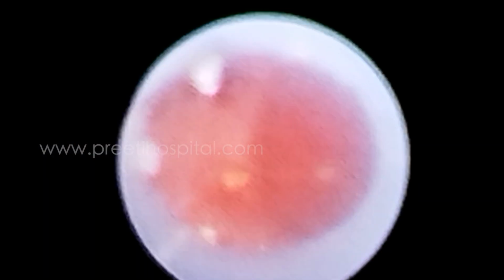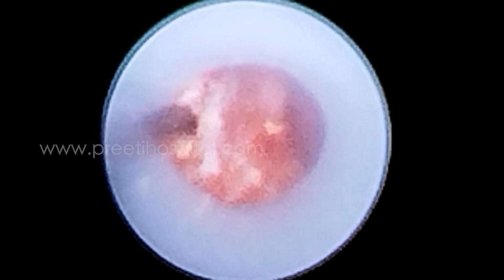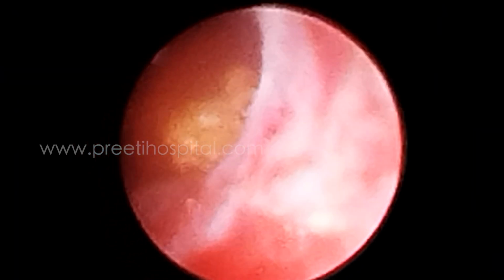Yes, sir. See, you should not flush when I am manipulating. That is absolutely wrong. You made it go up, unnecessarily you made it go up. When I am handling, you should never do that. No, it has gone in front. You see, here everything is there and unnecessarily you have flushed too heavily. So over enthusiasm is also dangerous. So now that piece I have to catch. Okay. Center. To break in the center.